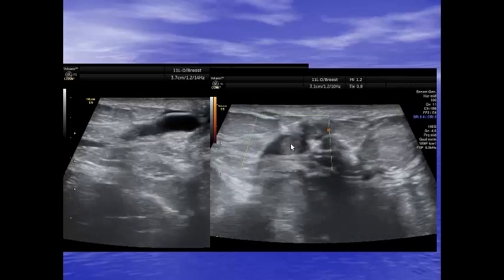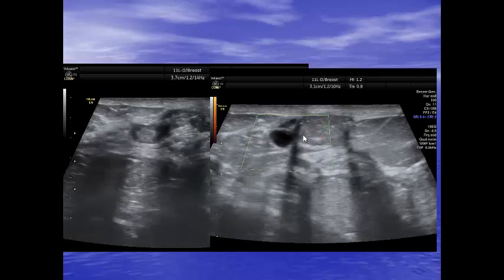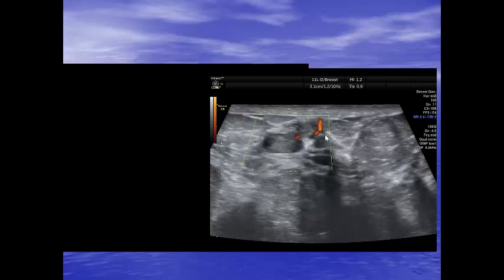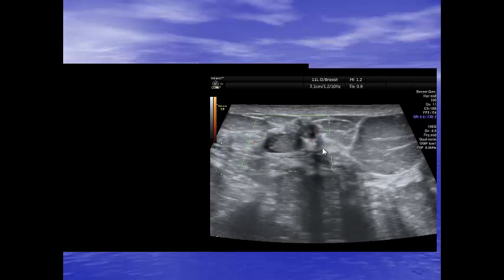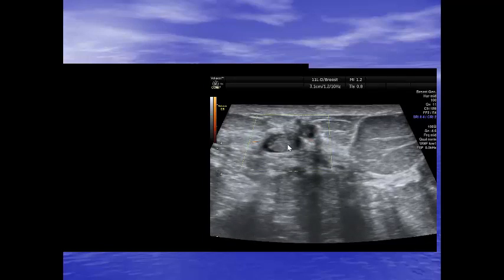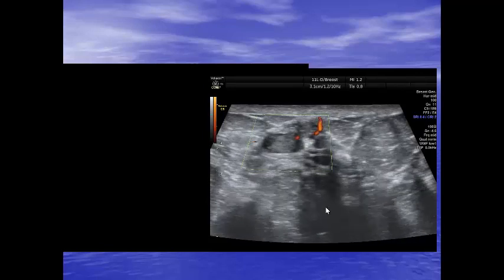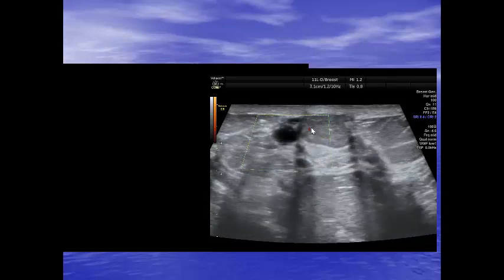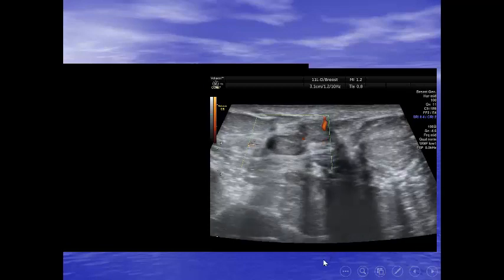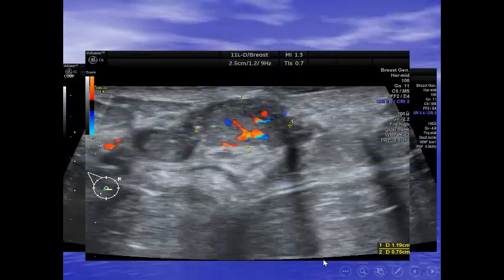This is the secretion we mentioned, but here there is a mass causing focal dilation of the duct with microcalcifications. There is vascularity present inside the mass — in the secretion area there is no vascularity, but in the larger mass there is vascularity inside. This is the large mass showing vascularity inside.